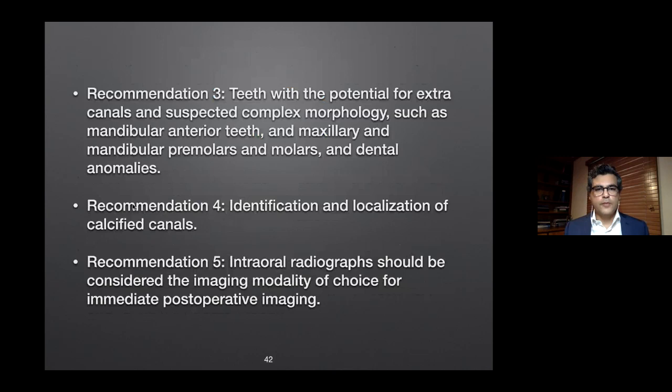Identification and localization of the calcified canal. So if you took a periapical and it seems that maybe the canal may be calcified, you cannot see the canal, that may be an indication for cone beam CT.